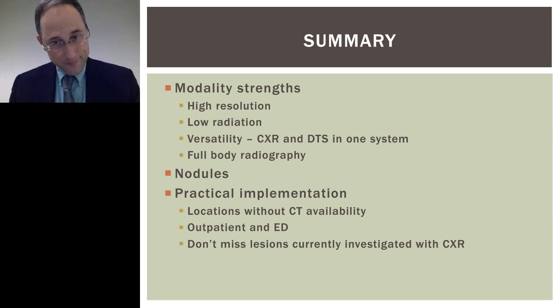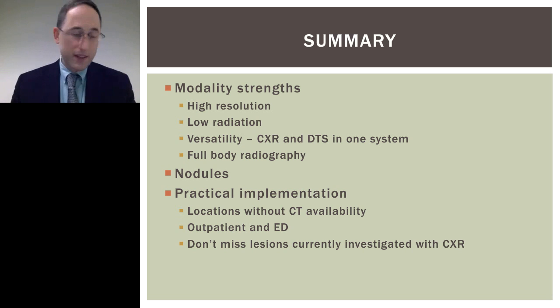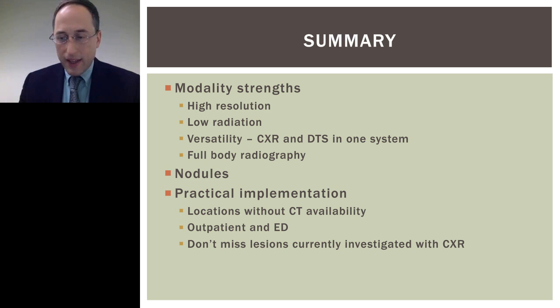In conclusion, okay, I think that tomosynthesis is a fantastic modality, and I honestly feel that way, and that's why I was very, very excited and happy to give this talk, because I think that there's a lot it can do for patients. I think it is not a financial stress for a lot of institutions to have this modality, and there's really a lot of effective patient care that can be delivered, and I really want to help people lower that barrier to making that happen.